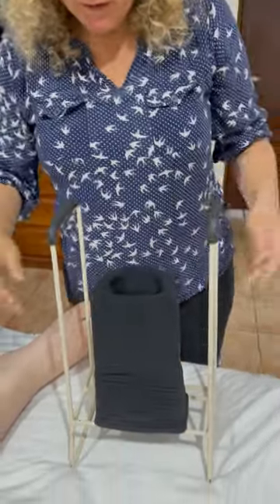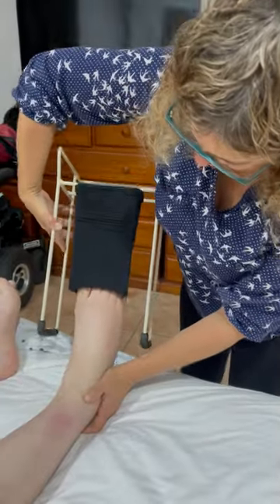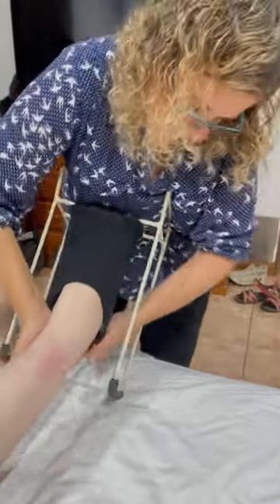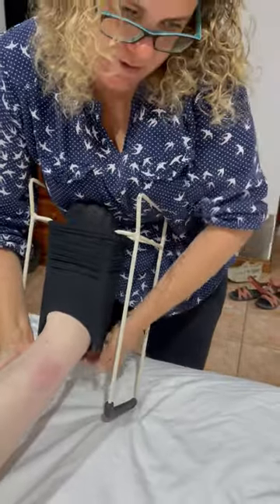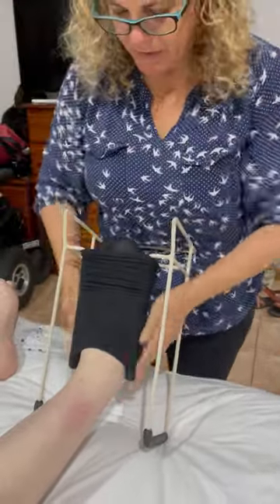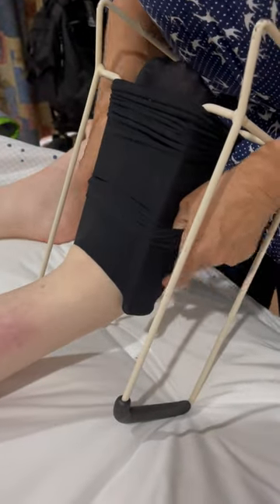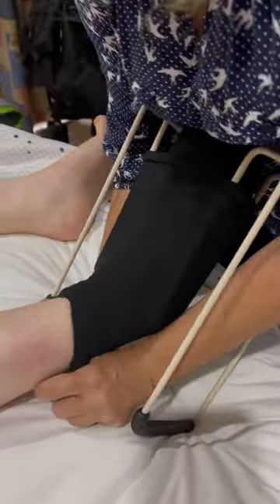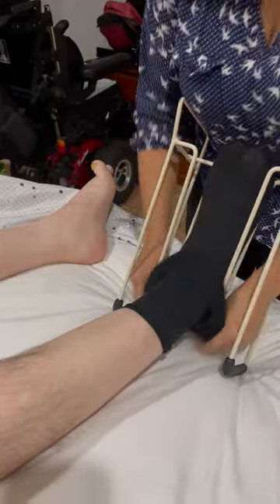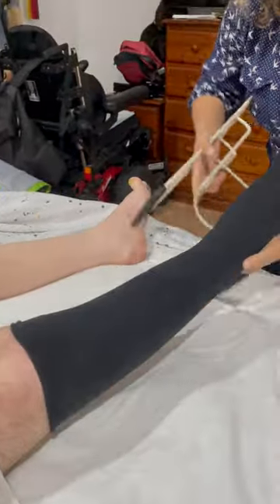Then we turn it around, take the foot carefully, put it over the toes, then bring it all the way in so that the heel — the little bar at the bottom — is over the heel. Rest it there for a minute, then pop your fingers in about halfway and stretch it over so that it's nice and flat.